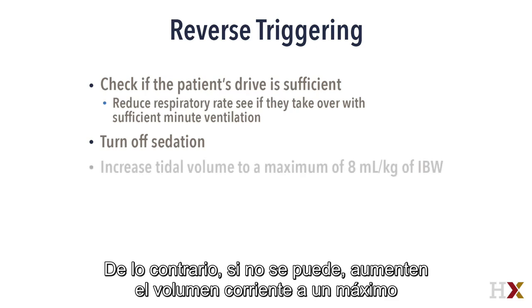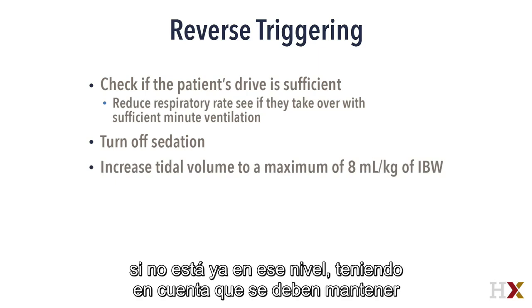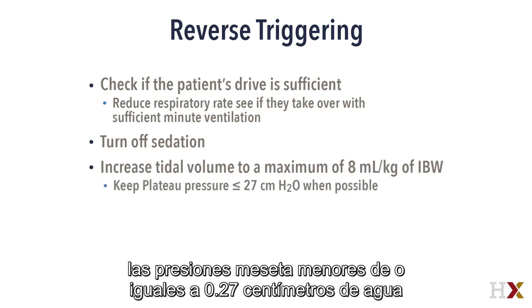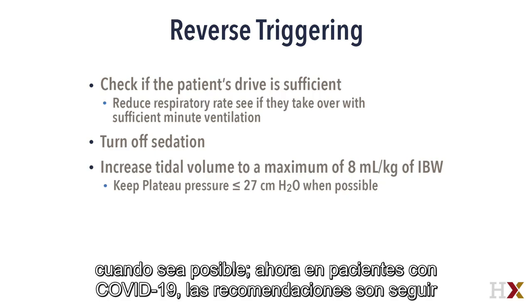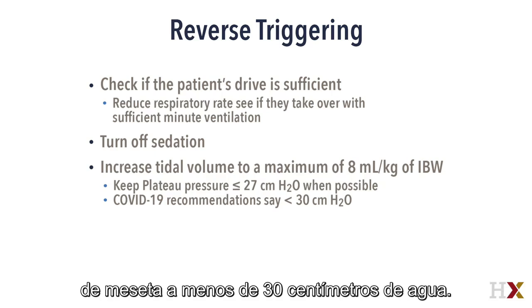Otherwise, if you cannot, increase tidal volume to a maximum of 8 milliliters per kilogram of ideal body weight if it isn't already at that level, keeping in mind that we should keep plateau pressures less than or equal to 27 centimeters of water when possible. Now, in COVID-19 patients, the recommendations are to follow those of typical ARDS guidelines, which is to minimize or limit plateau pressure to less than 30 centimeters of water.